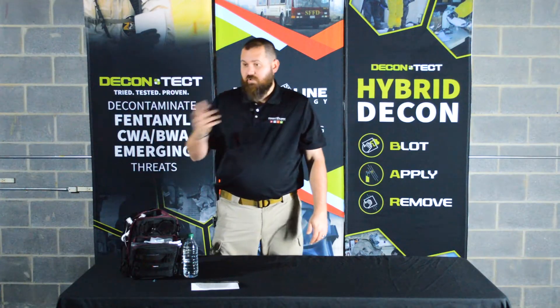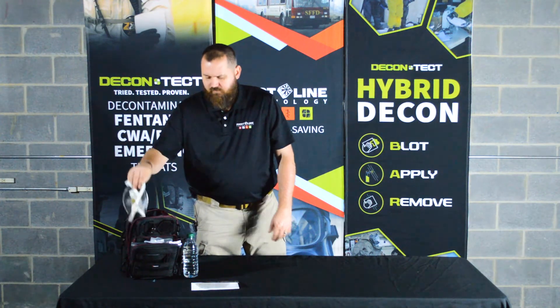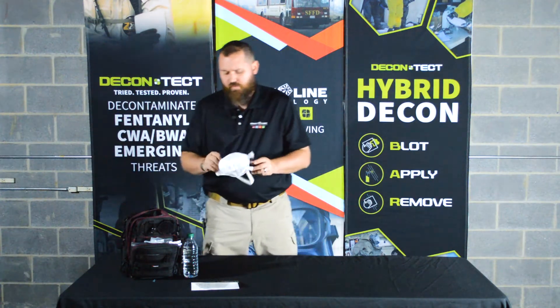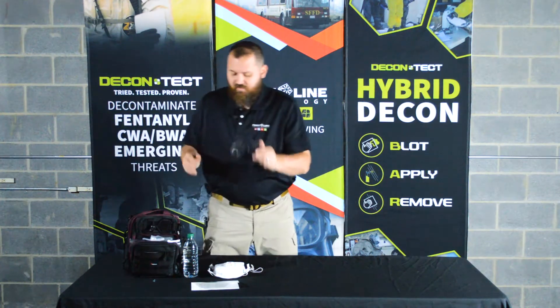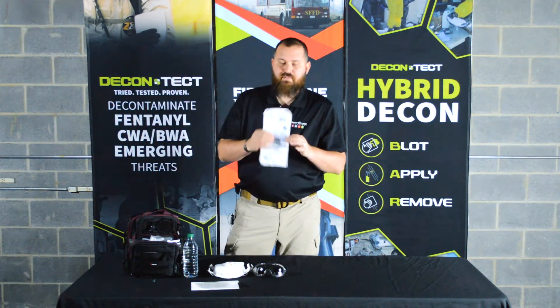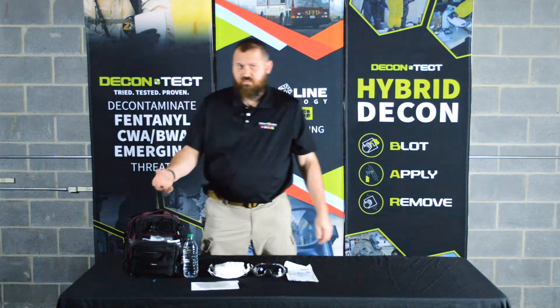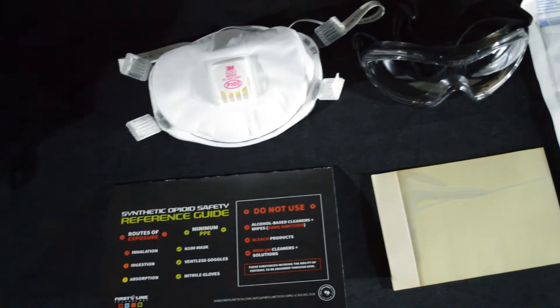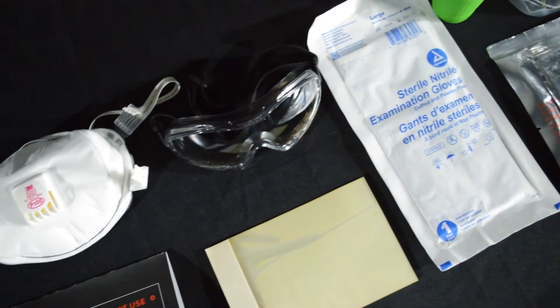The most important thing when dealing with synthetic opioids is to have the right protection. So according to NIOSH guidance and Firstline guidance, we're going to give you a P100 mask, ventless goggles, and individually wrapped nitrile gloves. For handling small street quantities of fentanyl and carfentanil, this is the level of PPE that you need. You don't need anything crazy — you don't need supplied air unless you're going into a lab situation, which is not what this kit is intended for.